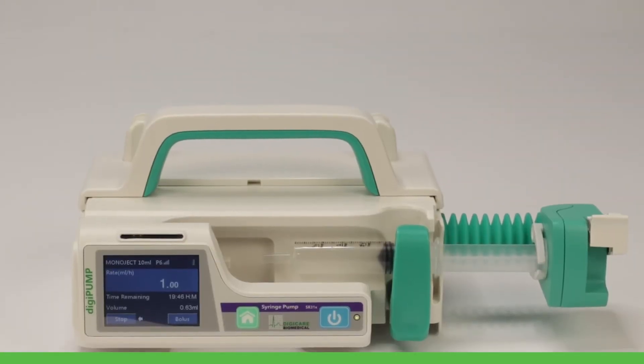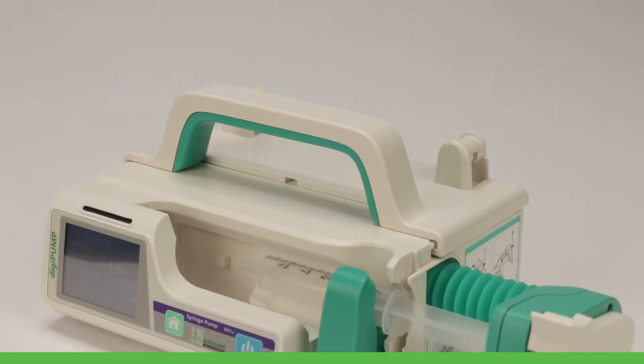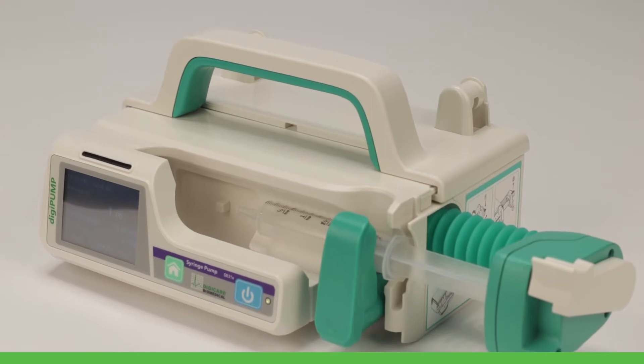The DigiPump SR31X is a veterinary-specific multifunctional infusion system that is the ideal solution for any type of animal hospital.